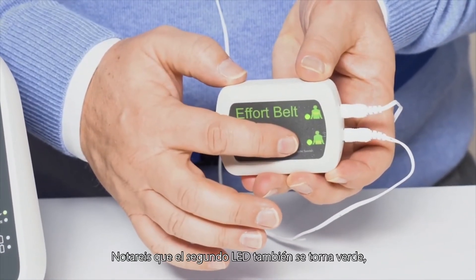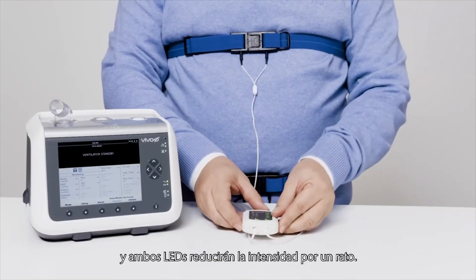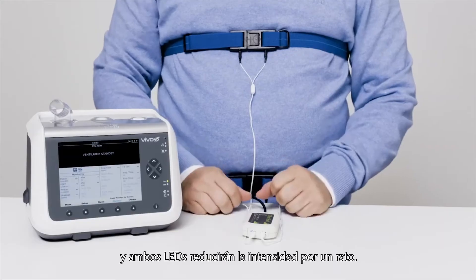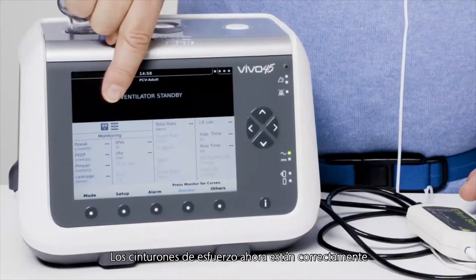You will notice that the second LED also turns green, and both LEDs will dim after a while. The effort belts are now correctly installed.